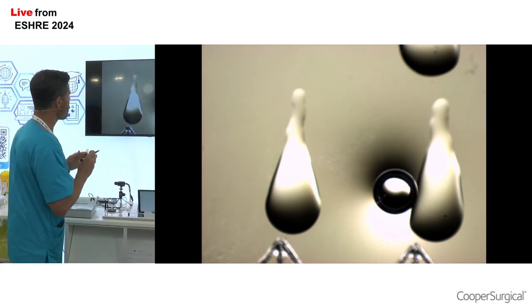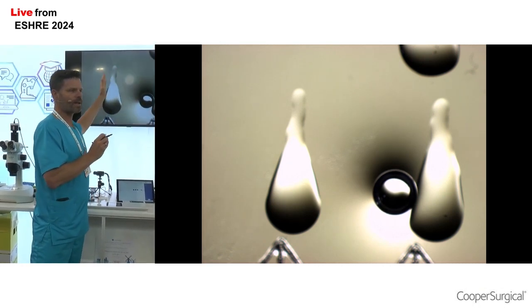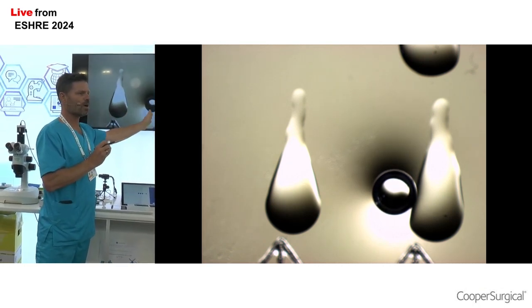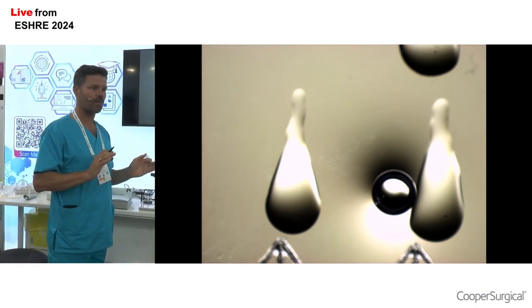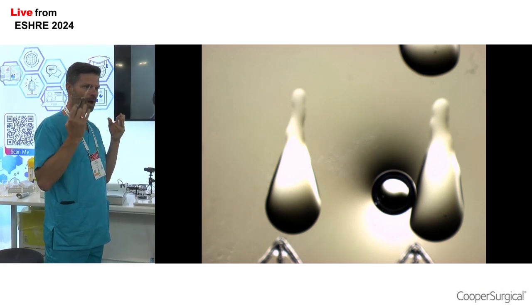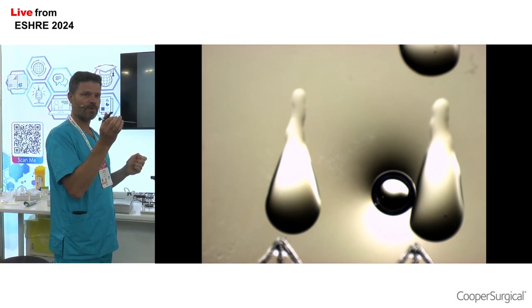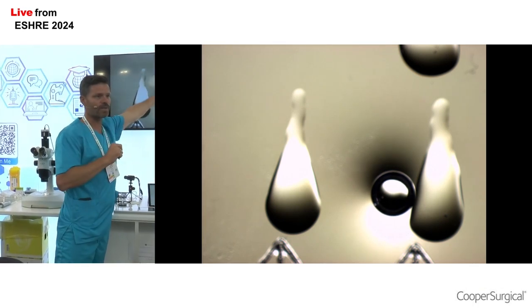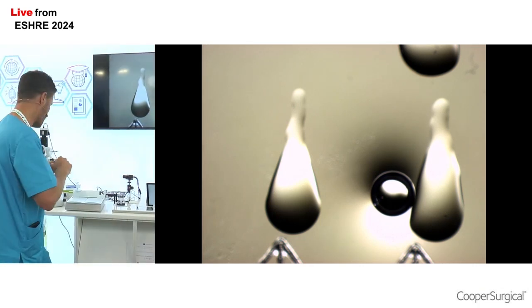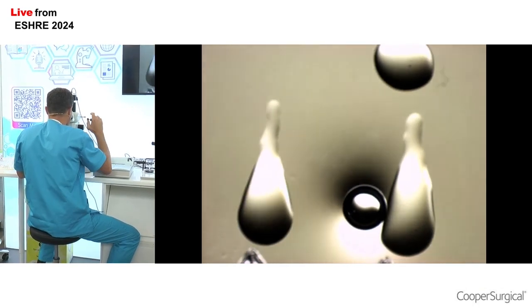And what I'm actually going to do in each of these 3 drops that I prepared is make a slightly different concentration of sperm. Now I'm just going to do it. It's not a specific volume that I'm going to put in or a concentration. I do it by eye using the stereo microscope, and I'm going to use the stripper tip to take a small volume. I'm going to put a small amount in the first drop, a little bit more in the second drop, and a little bit more in the third drop. And I'll explain a bit why it's nice to have 3 different concentrations in a minute.